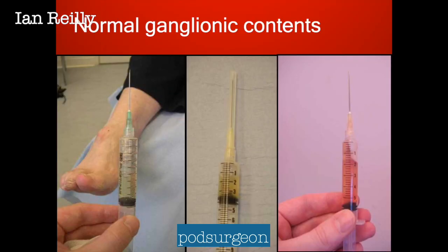And this is what you're looking to see — normal ganglionic contents. You can see the syringe on the right is very slightly pink; that's probably a little touch of blood in that.